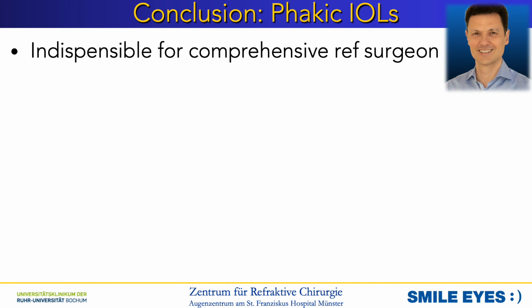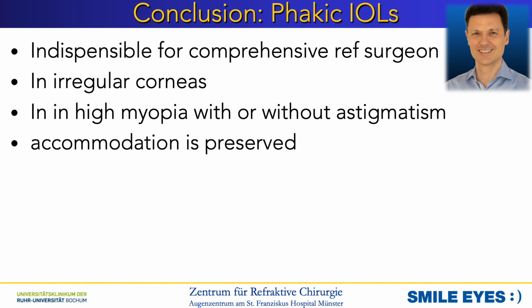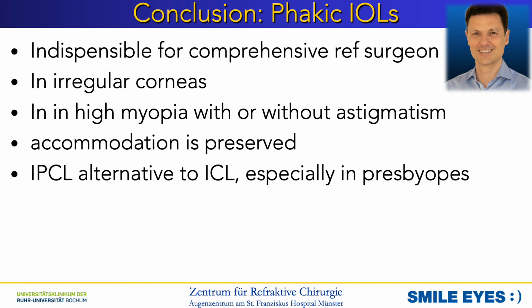So in conclusion, phakic IOLs are indispensable for a comprehensive refractive surgeon, especially in irregular corneas where you don't want to do laser vision correction. Also in high myopia or high astigmatism outside the range of laser vision correction. The beauty is that accommodation is preserved with phakic IOLs, and the IPCL seems to be a promising alternative to the ICL, especially in presbyopes.